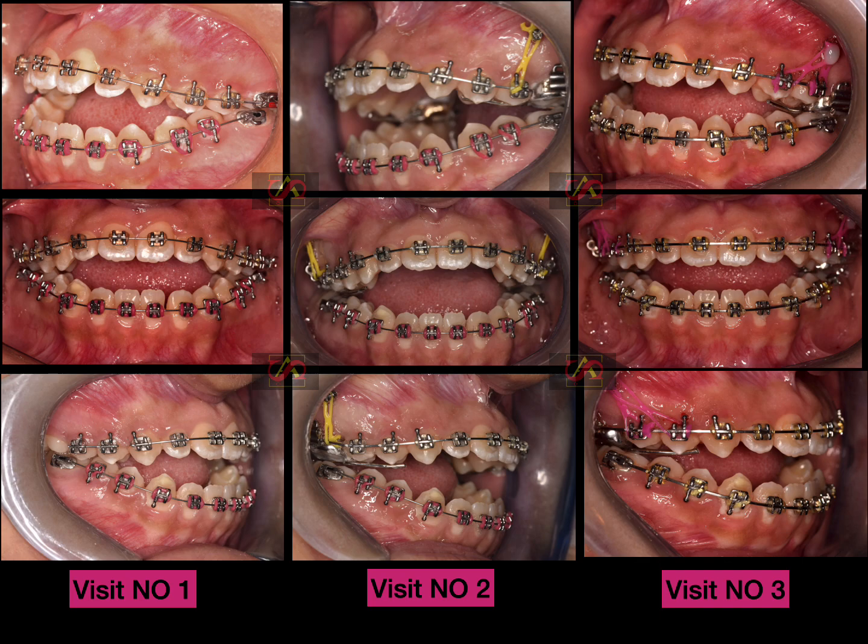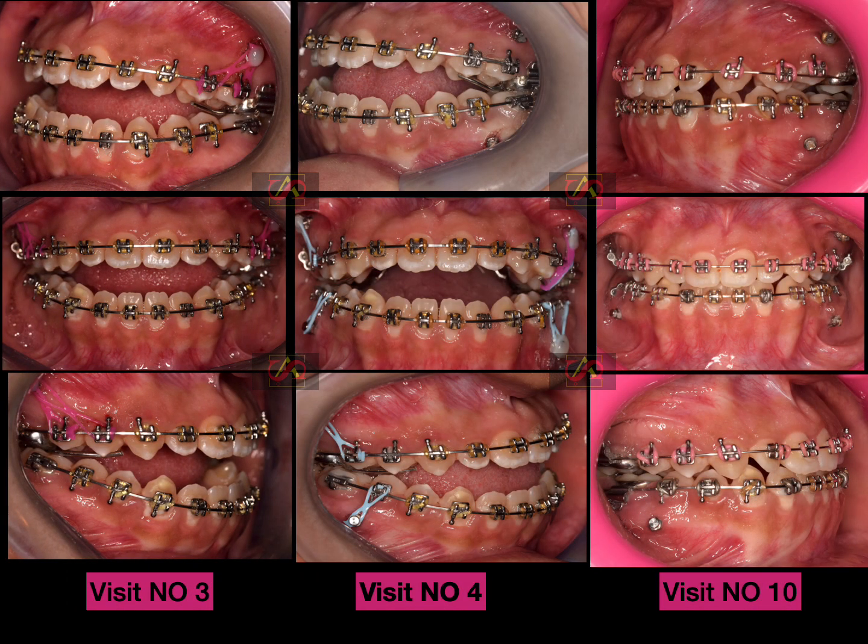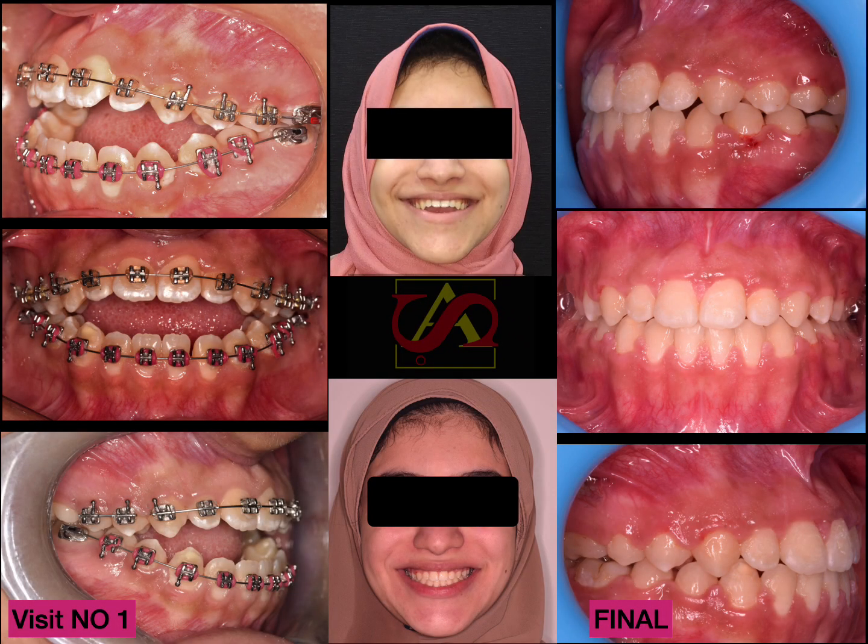I'll discuss this in detail in the next slide. This open bite closed slightly and then closed completely at visit number 10. So this open bite closed completely.